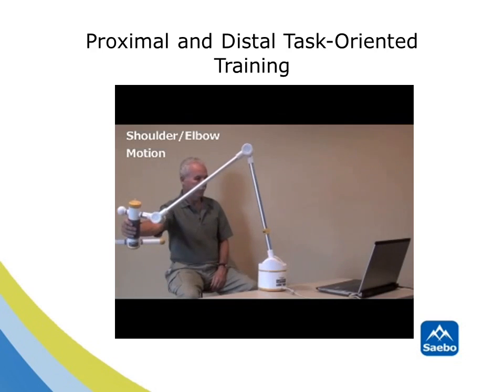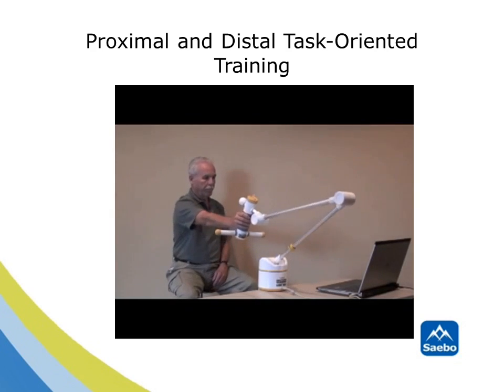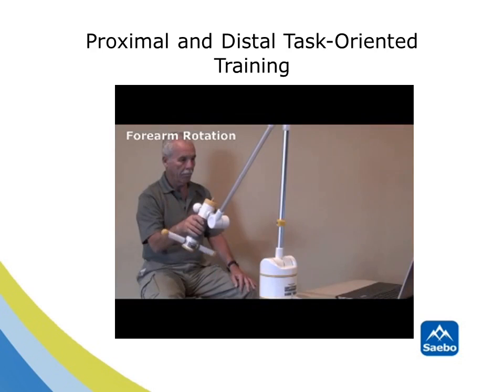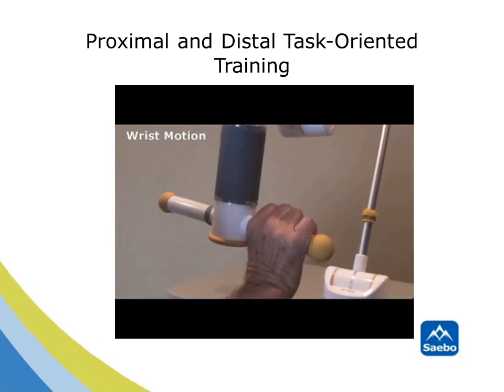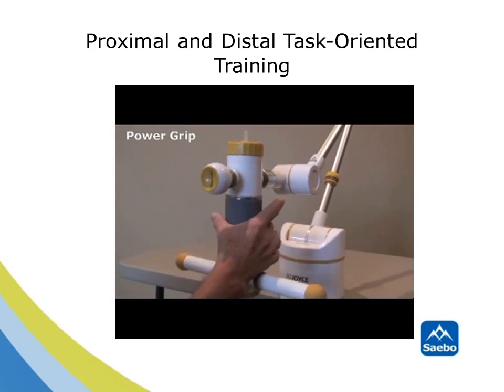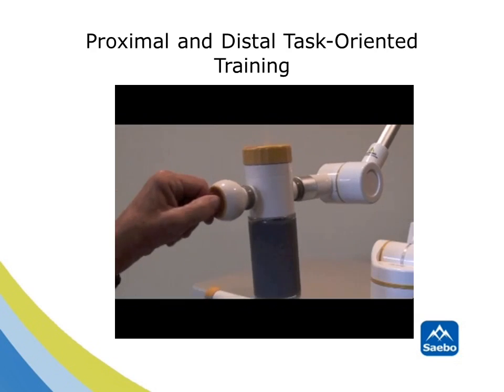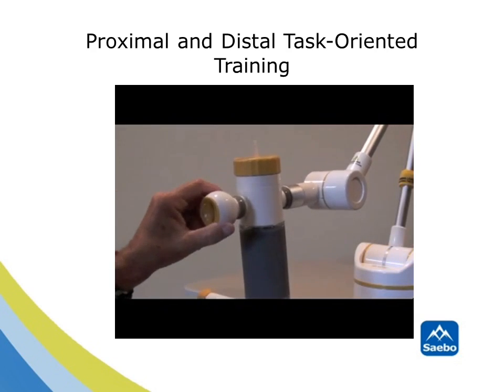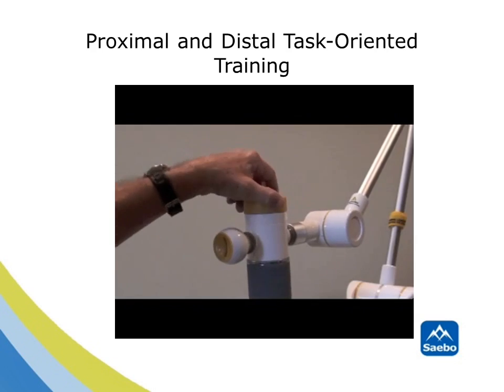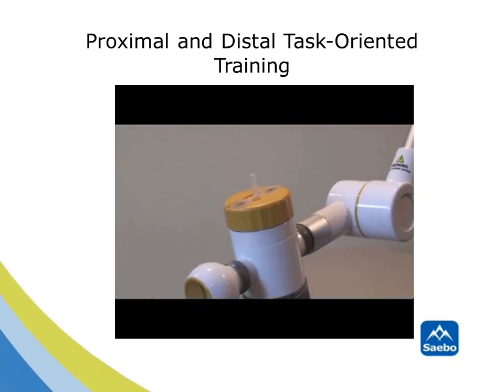When working with the SABO Rejoice, your client will be able to practice proximal and distal tasks. For instance, shoulder abduction and adduction, as well as shoulder flexion combined with elbow extension, is possible. For distal training, you'll be able to perform pronation and supination, cylindrical grip for wrist extension and wrist flexion, power grip for grip strengthening, lateral pinch or key pinch, a modified spherical prehension pattern, as well as a spherical prehension pattern. Finally, you can do tip-to-tip pinch, as well as finer precision handling, such as simulating picking up coins.